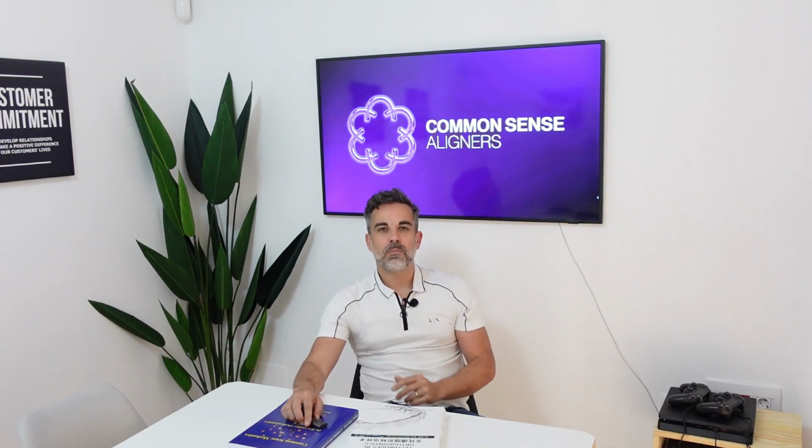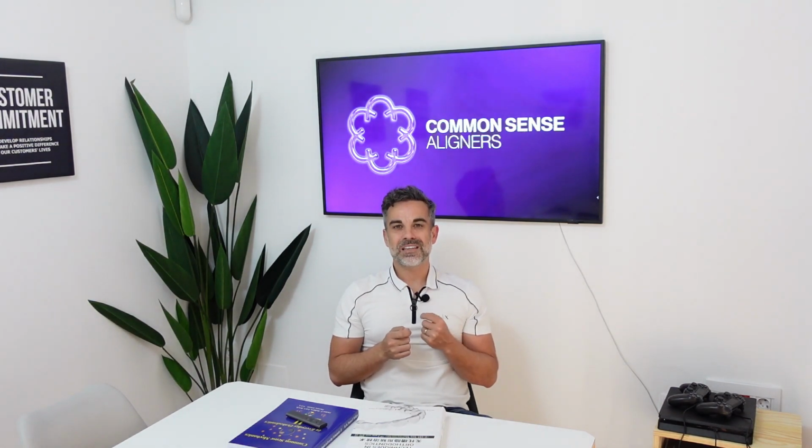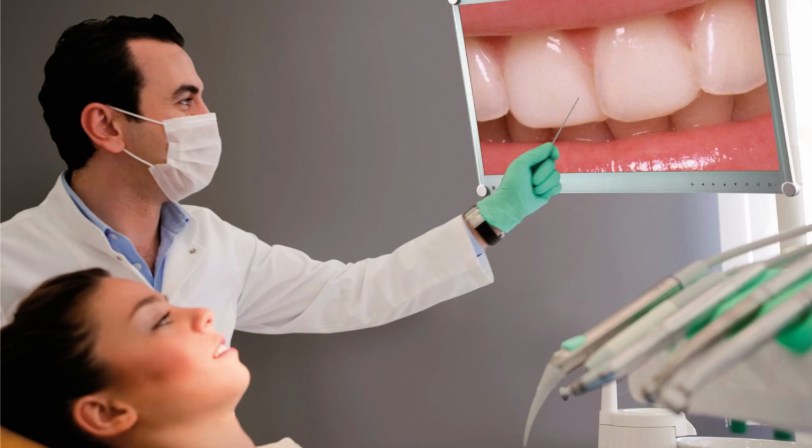Sometimes I see some colleagues, we all pay attention to resolution. Okay, so we think it is quite important that I have this great resolution with my new CBCT machine. I know it is important because we want to pay attention to the details. But sometimes, we may spend maybe 10 minutes looking at an impacted canine because of the resolution, that it is perfect, it is really high, but we cannot integrate it with the digital treatment plan. For example, if you're doing some in-house aligners, that is not going to be useful. In the end, we're going to forget using it because it's not going to be efficient.